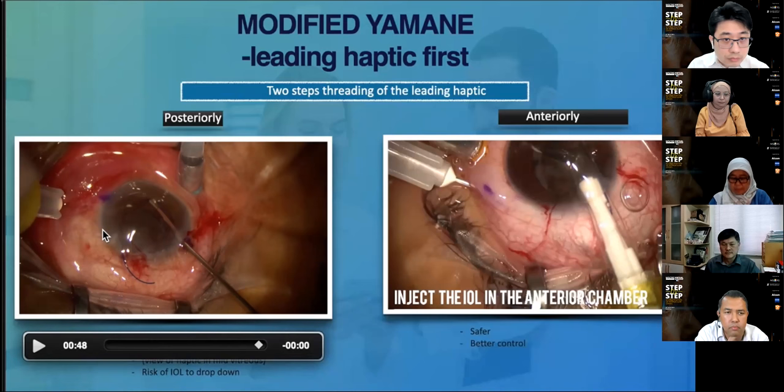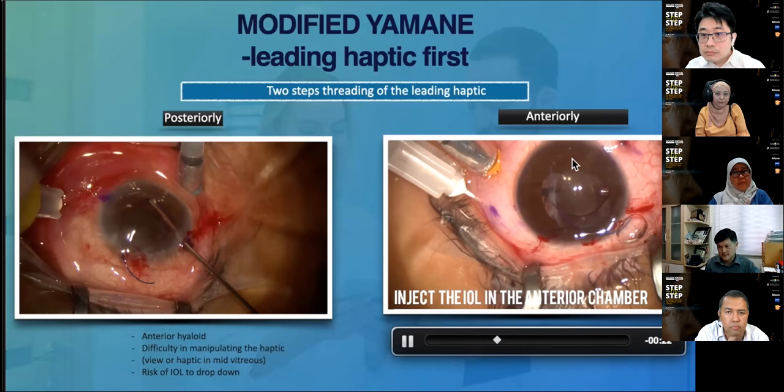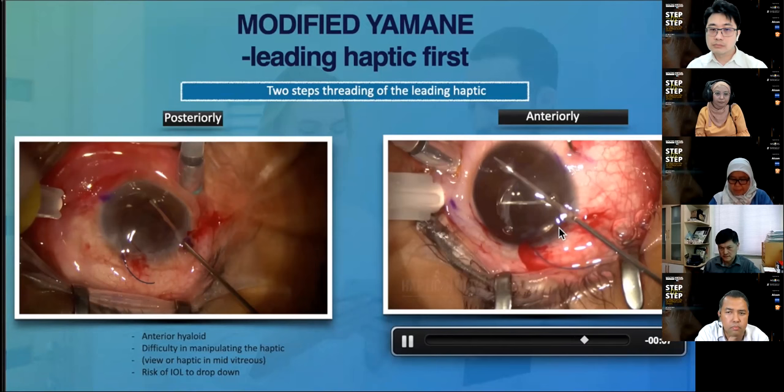Another way is by placing the IOL in the anterior chamber. I prefer to do it this way, whereby you inject the lens in front of the iris and park it at the angle. Of course, you can do this if you have a normal angle. And reposition it so that you can have access to the haptic. And then only use a forceps to thread it into the needle.